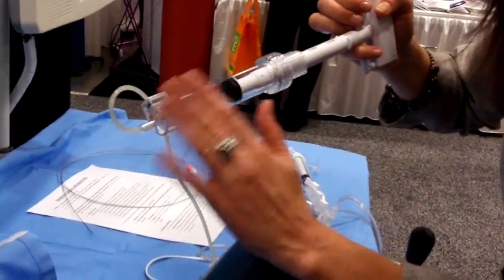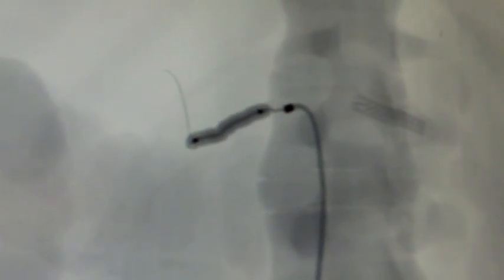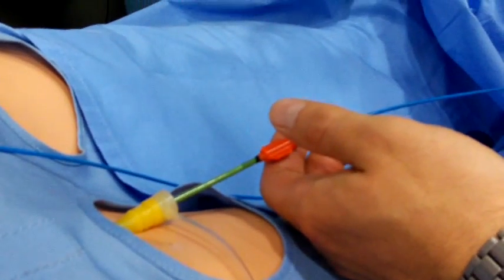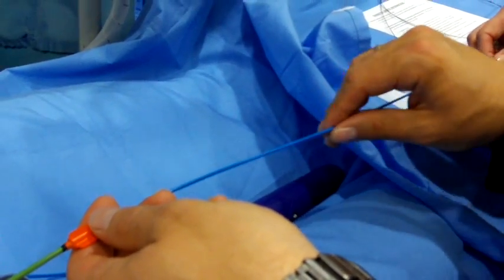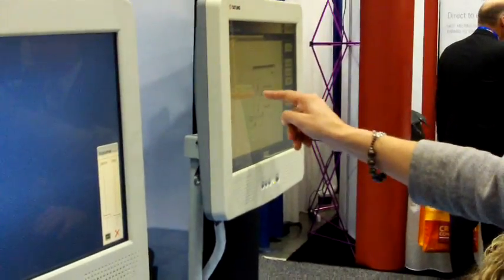I would use this device — it hooks up to the balloon, it's filled with contrast and saline. As I start to turn, you can see on the screen that it's inflating the balloon. The stent is mounted on top of the balloon in the software. It looks a little better already. We're going to pull this back, keep the wire down there, remove this one — we'll do it just until the machine lets go. And I'm going to change that — this is going to become our stent.